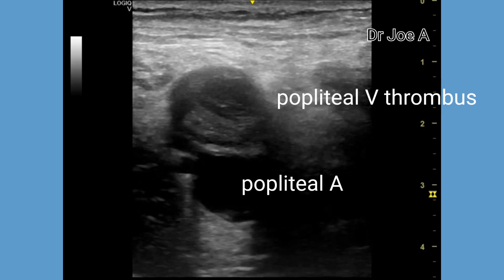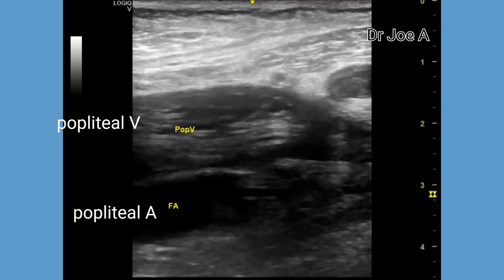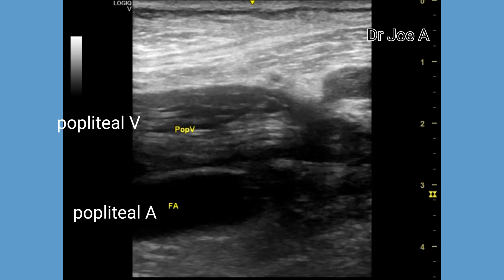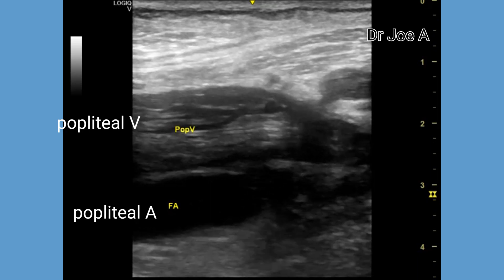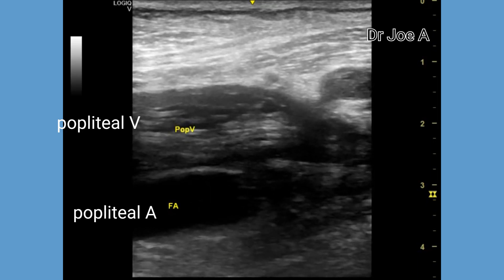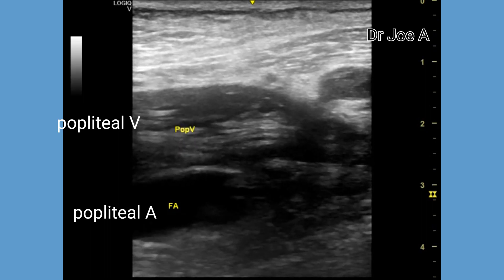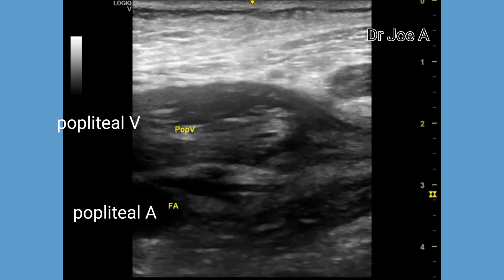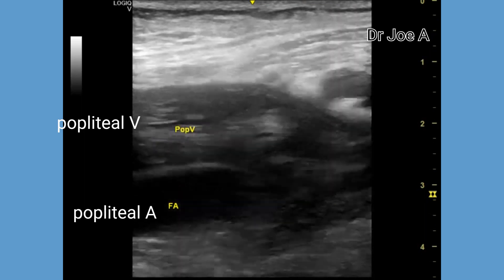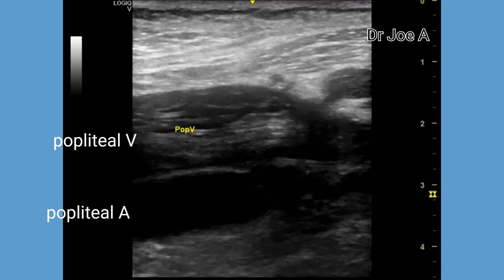As the popliteal vein thrombosis proceeds to a chronic stage, it would result in gradual fibrosis and contraction of the thrombus, resulting in a small or fibrotic popliteal vein. A long-section through the popliteal vein and popliteal artery shows the full extent of the thrombus located within the popliteal vein.